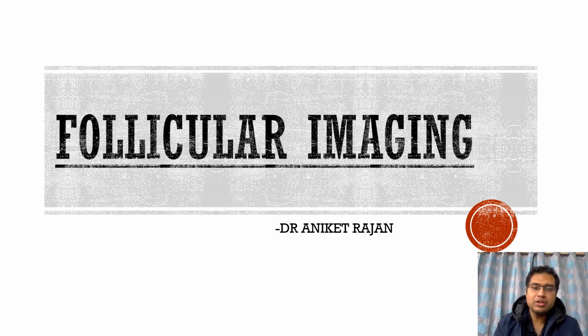Hello everyone and welcome to this important and useful session on follicular imaging, and today we'll be discussing all about follicular imaging. It's a very common scan that is done by the radiologists, and because of so many new techniques and methods that have come up, it is very important for us to be updated.